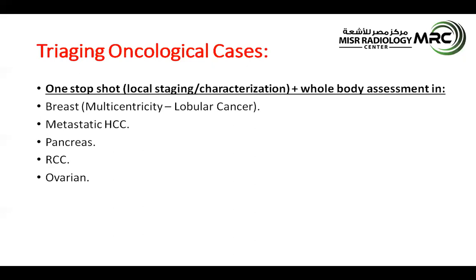There are also the ovarian malignancies. In the staging of ovarian malignancies, we are talking about the importance of MRI in the local staging, the assessment and characterization of the different ovarian lesions, and the spotting of the distant metastatic assessment, which of course includes the peritoneal involvement.